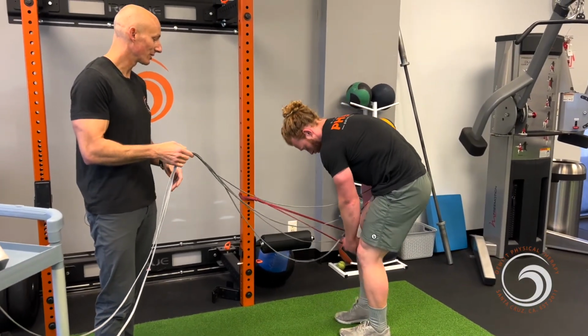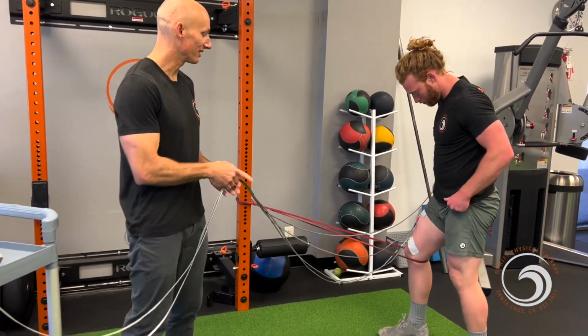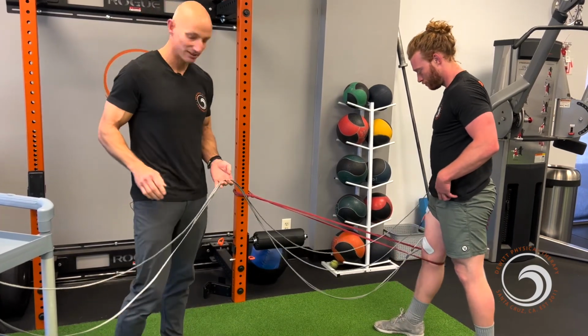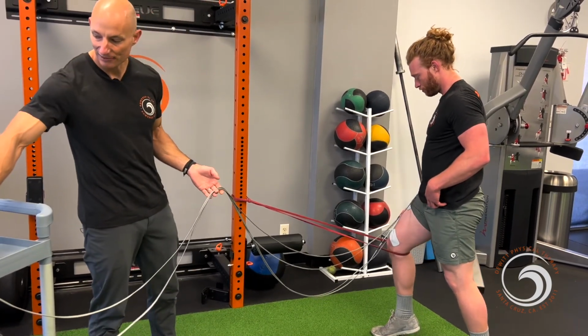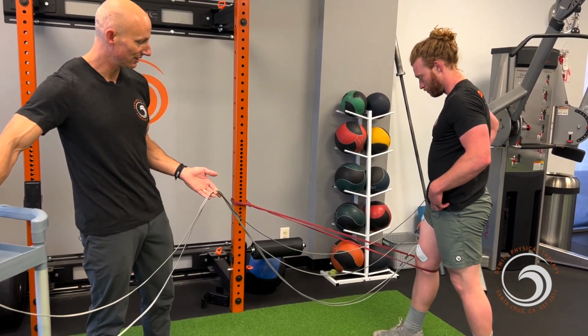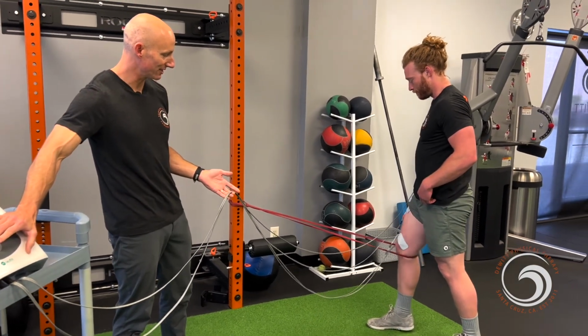So now we're going to progress him up into more of a standing, weight-bearing phase of rehab. And so I'm just going to have you do some terminal knee extensions. And actually, Elijah, while you're there, I'm going to add that posterior chain into this. So tell me when you feel something. Yeah, I kind of feel it in the glutes and hamstrings. Perfect, great. And then go ahead and tell me when it's that same 6, 7 out of 10.